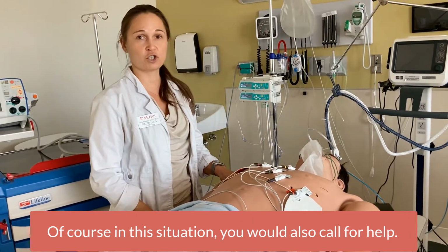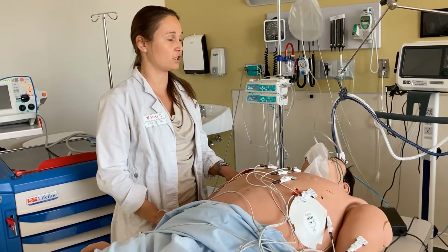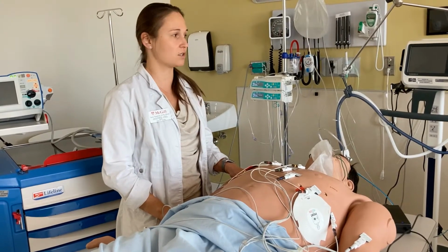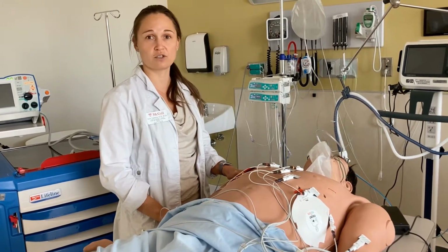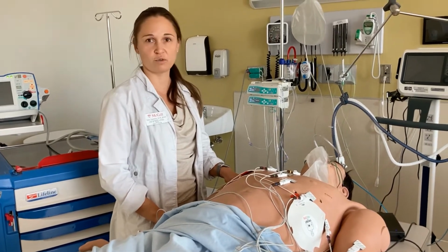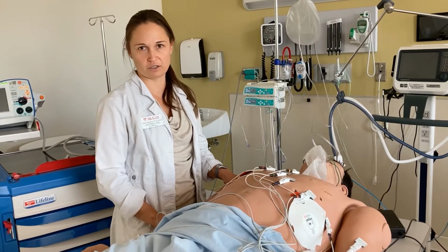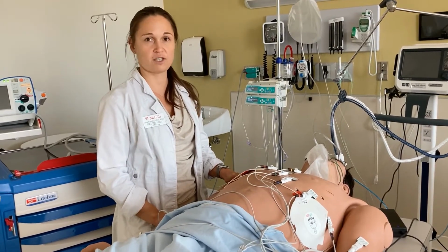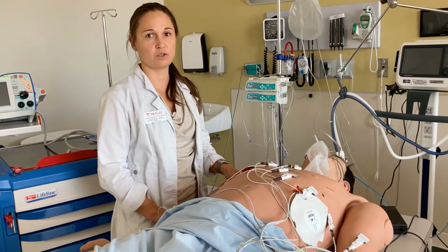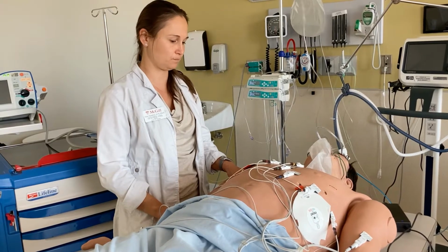Now, cardioversion is usually done as an emergency procedure, but there does exist cardioversion that is elective. For example, for conditions such as new atrial flutter or atrial fibrillation, or an atrial fibrillation that is not changed with pharmacological interventions. So these procedures can be done electively, but in a critical care setting, you will see that cardioversion is also done as an emergency intervention.